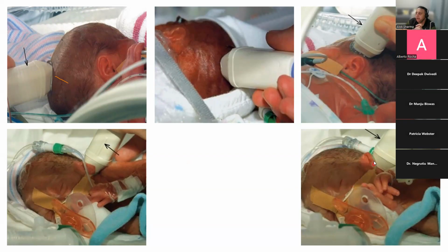This view will basically give you a very good view of the ventricular system. And if you can take those images along with whatever Dopplers are indicated, then what you are doing is a comprehensive scan. It's not an enhanced scan, but it's all you need. And we'll talk about the types of scans as we move forwards.